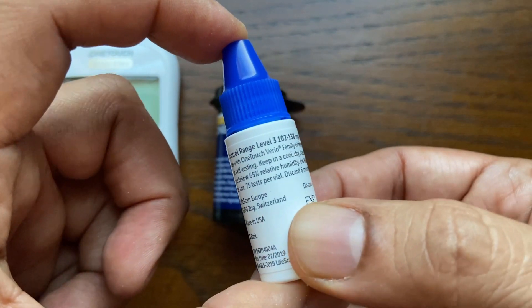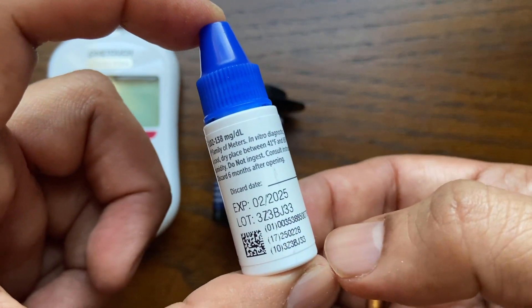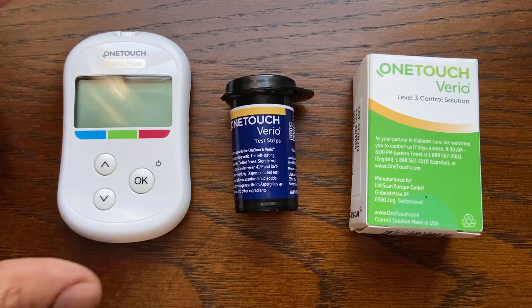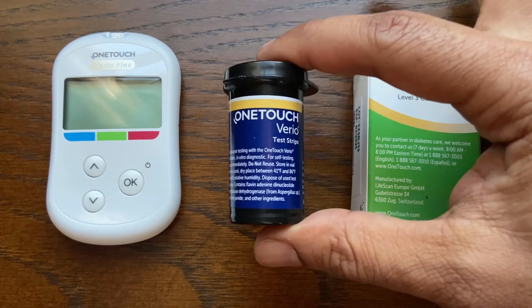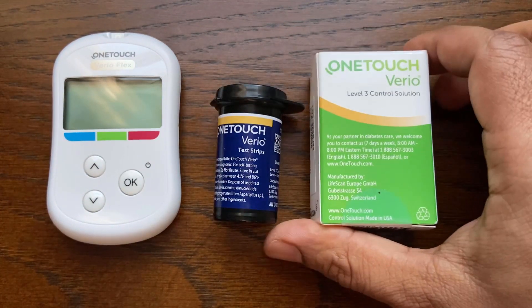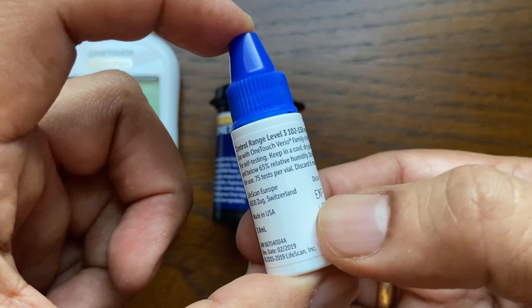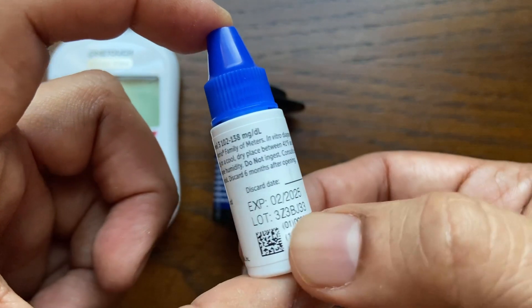This video demonstrates how to check the OneTouch VarioFlex Blood Glucose Meter using the control solution. To do this test, you will need the meter, a test strip, and a bottle of OneTouch Vario Level 3 or Level 4 control solution. Either level can be used to check your system. The video description section contains a link to get the control solution.